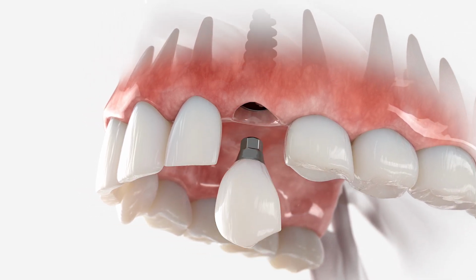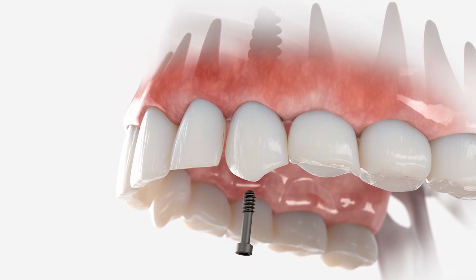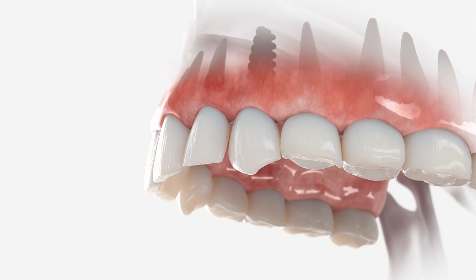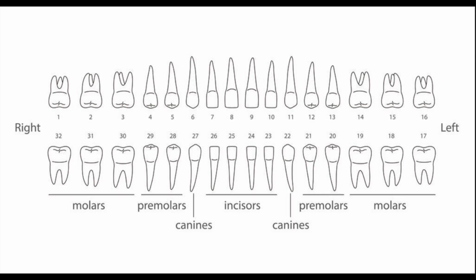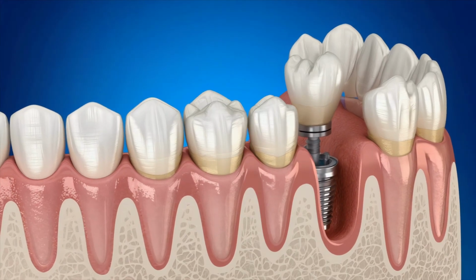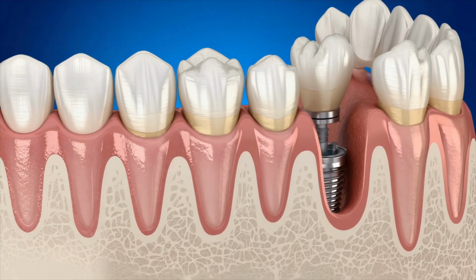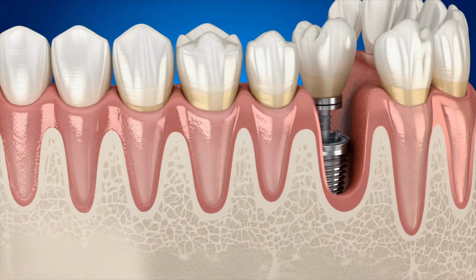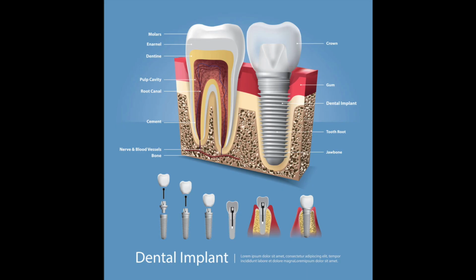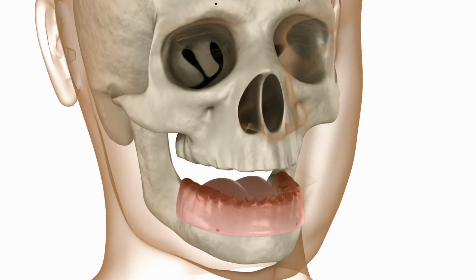This moves the junction, the microgap, inward, away from the crestal bone. Biologically, this encourages the soft tissue to grow inward, creating a protective cushion and reducing the inflammatory response, thereby preserving the critical crestal bone level, the primary indicator of long-term implant health. The clinical impact is dramatic. Studies consistently show significantly less crestal bone loss around platform-switched implants compared to conventional designs, making it essential for aesthetic zones where bone volume is already limited.